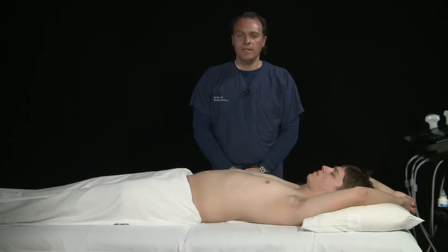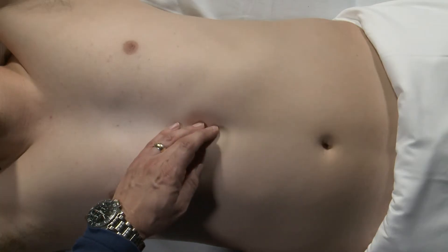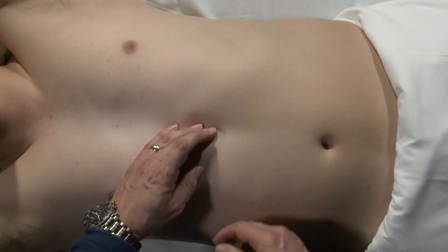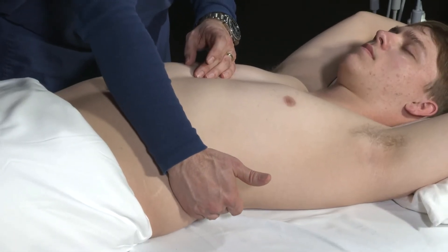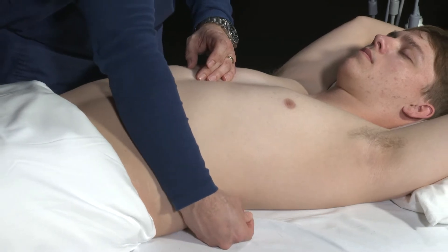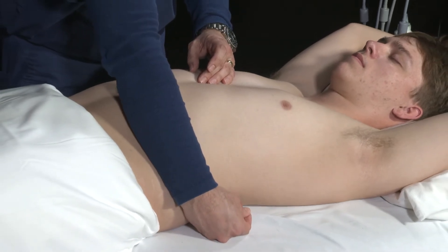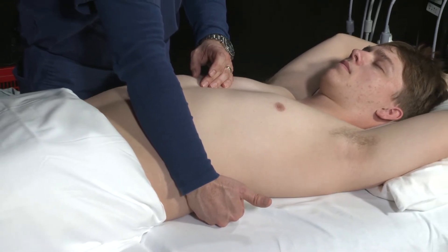When imaging the left kidney, we do not have the advantage of a large liver to help us as a large sonographic window. Therefore, our probe placement is going to be a little bit different on the left than it was on the right. We're first going to start off by finding the xiphoid process and drawing an imaginary line all the way to the posterior axillary line. Our hand is going to be resting up on the bed and the probe is going to be angled just a little bit anterior towards the patient's abdomen.